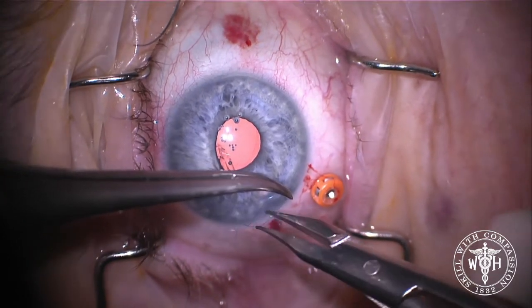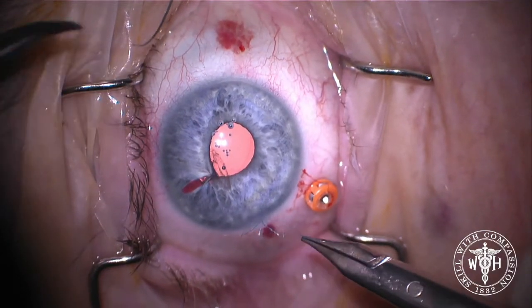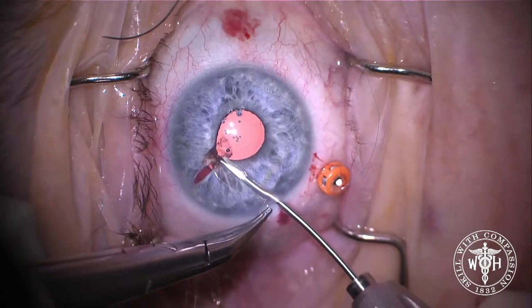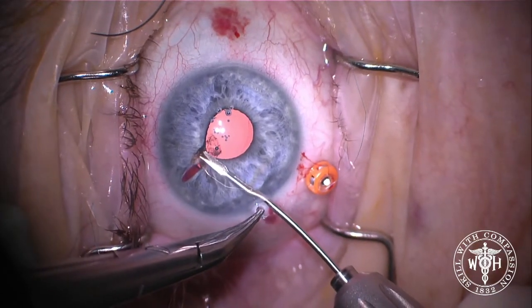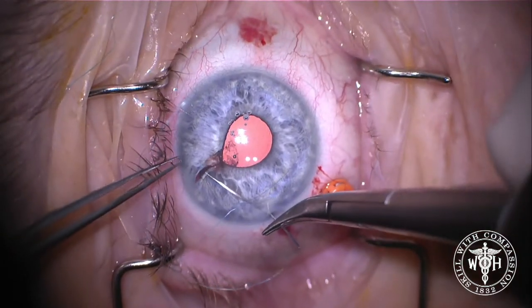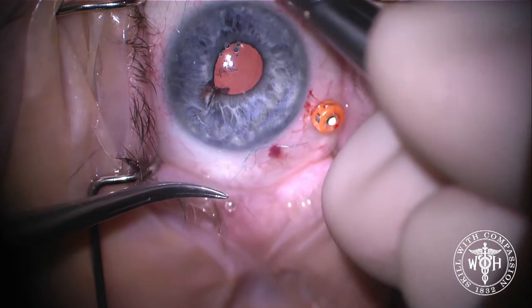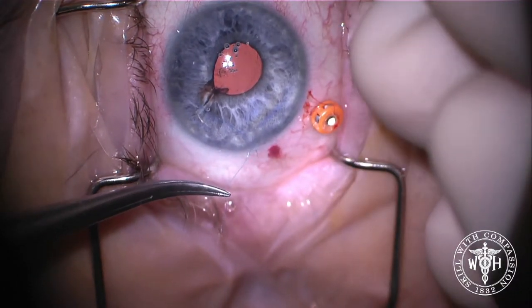It's a little hard to describe, and it's even harder to see when you're using prolene suture — it's so hard to see what's going on. Once that knot's tied, we'll go in with an intraocular scissor and cut the knot short. To close the rest of this, we just place one more stitch. This one here wasn't necessary, but I thought it would really help close the pupil.